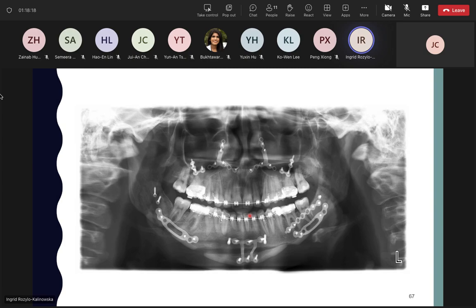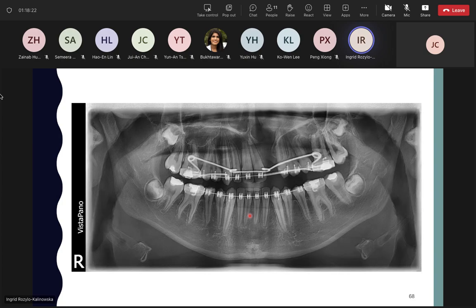So this is a patient with cleft palates and fixed orthodontic appliances with palatal arch. So again, it's not possible to remove these devices for the exposure. What you can remove is just the wire, the orthodontic wire, but in fact it doesn't really matter if the rest stays anyway.